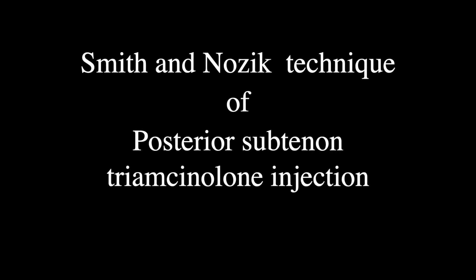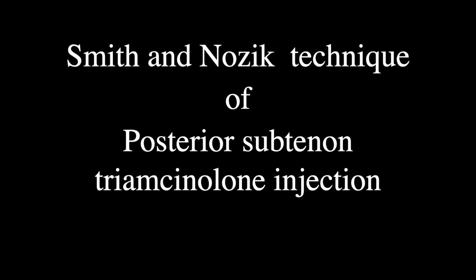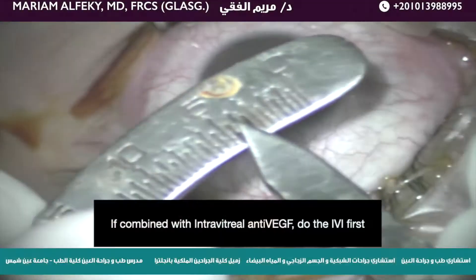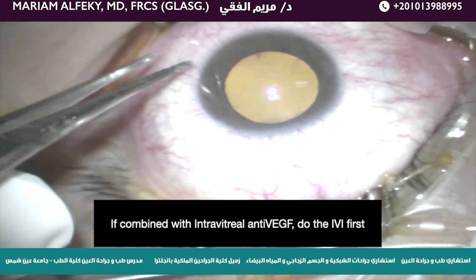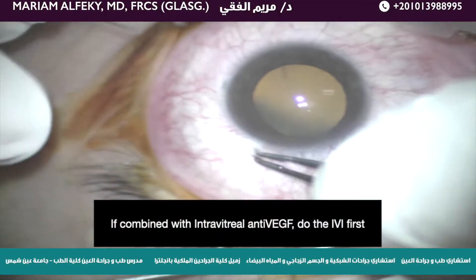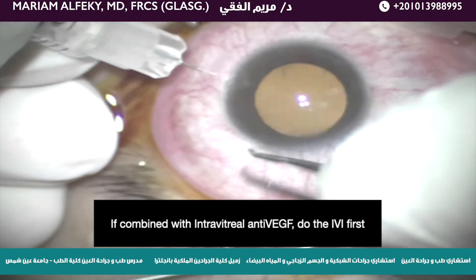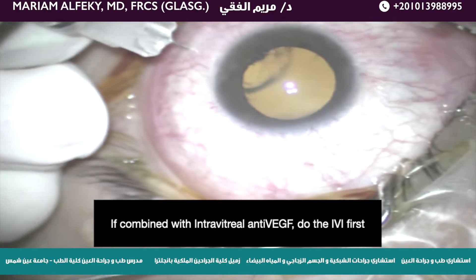This video describes the Smith and Nozick technique of posterior sub-Tenon's steroid injection. If it is combined with intravitreal anti-VEGF, give the intravitreal injection first, in the inferotemporal quadrant.